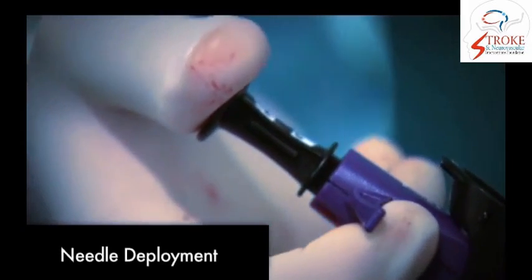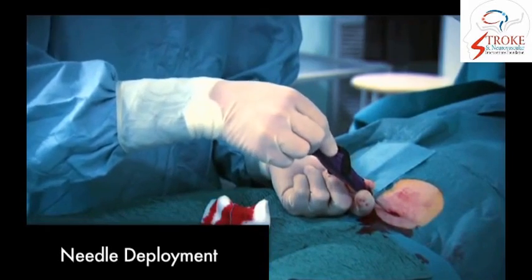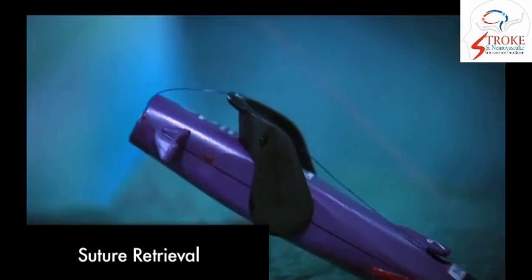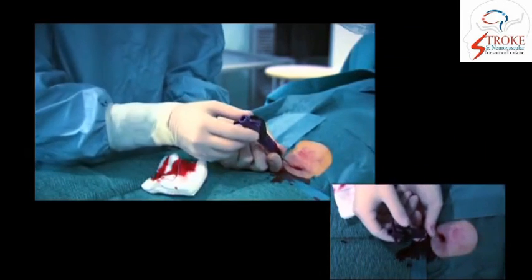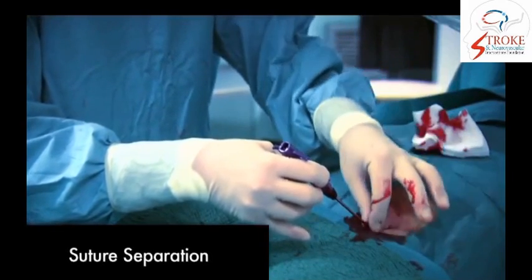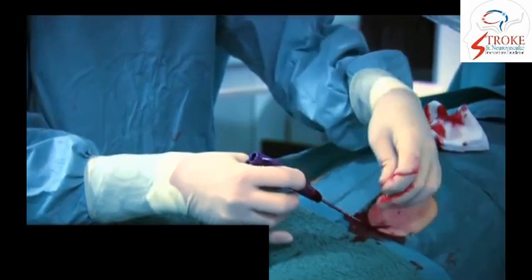and then the needle is being deployed, and then the suture is being retrieved. The suture is cut, then the foot is being parked, and then very carefully one withdraws the device, and one can see the sutures are separated from the device.